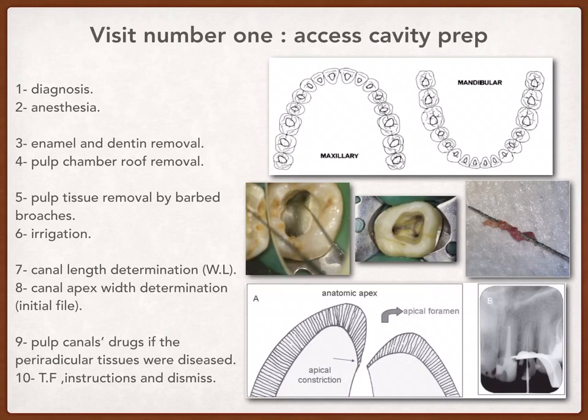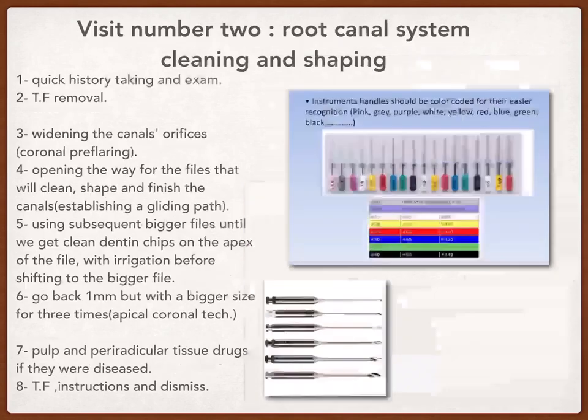And then in the third visit, obturate that canal according to that length and width correctly. After that, we fill the root canal system with a temporary medicament material that will enhance the healing procedure in the periradicular tissues, and then dismiss the patient.